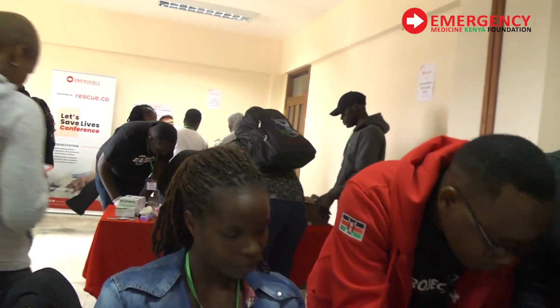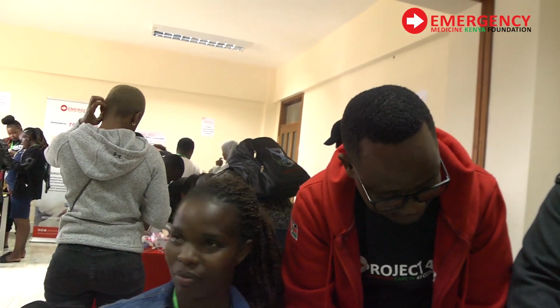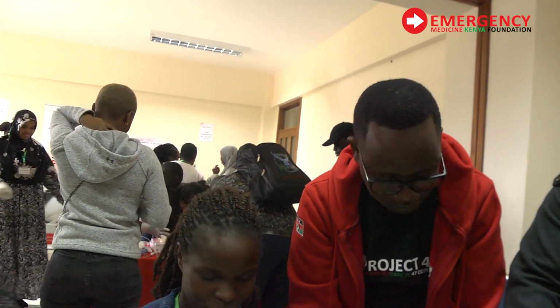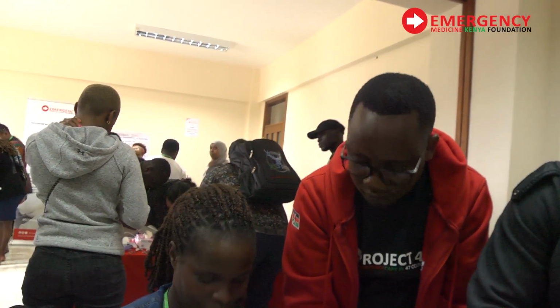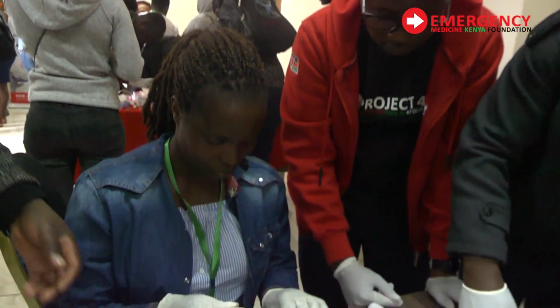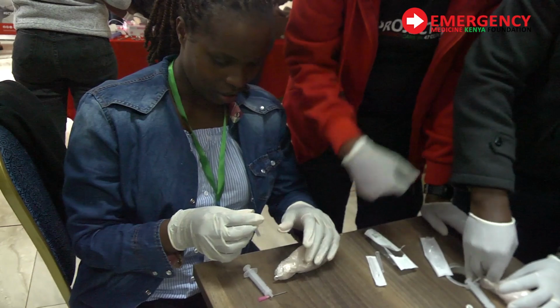So much resistance that I'm not doing it. So the reason is simple. You see what you see? You have located the site. I want you to use this part of the finger to push the needle down, and these two to just rotate. So this gives you the force, like you're pushing down as you rotate. You see, I'm already in.